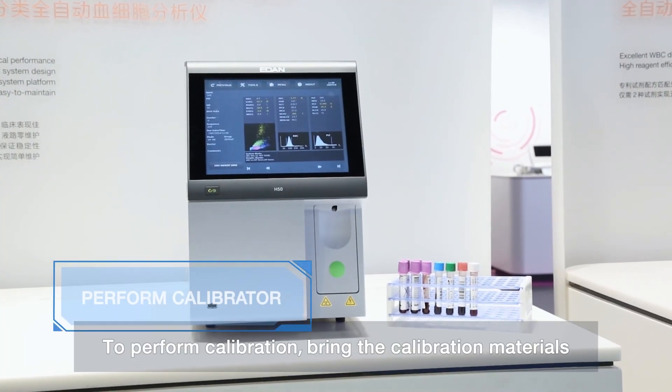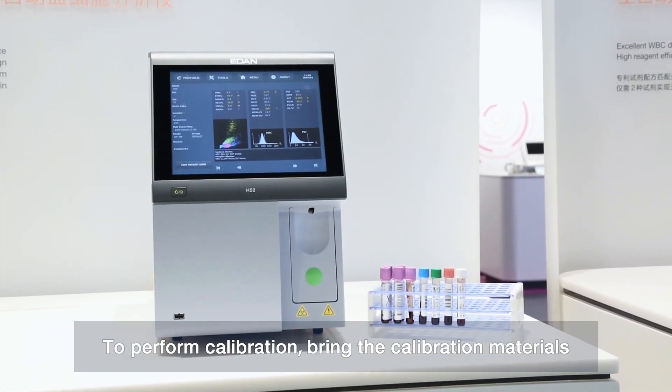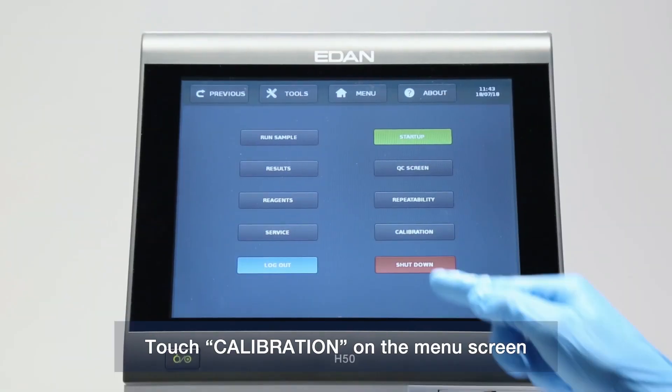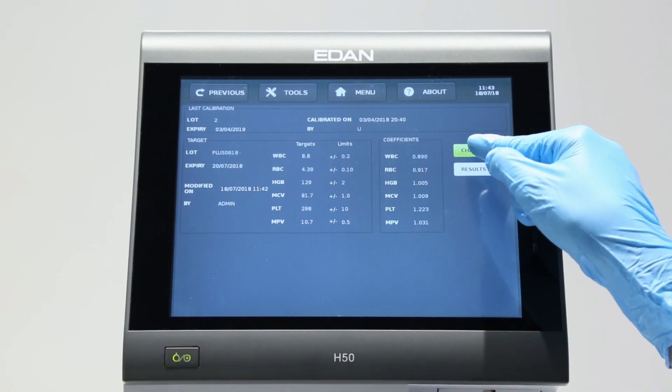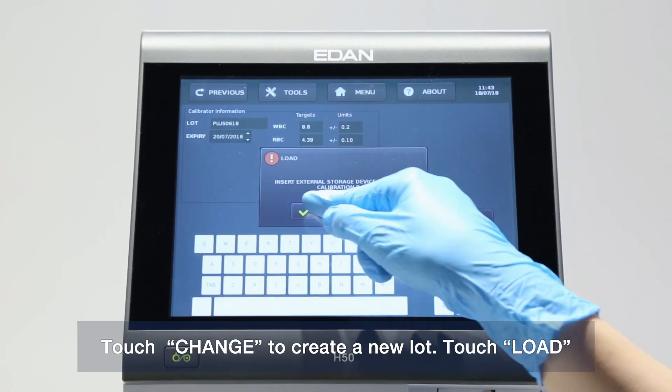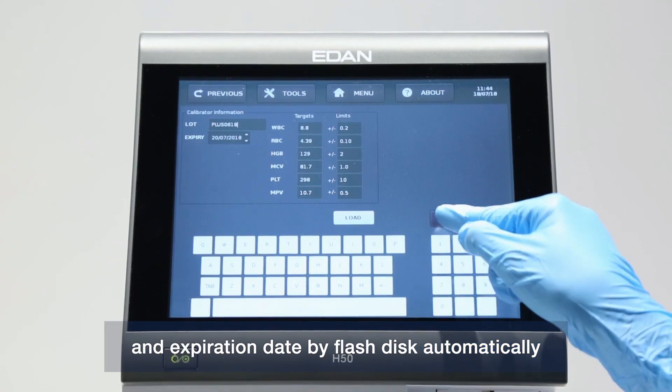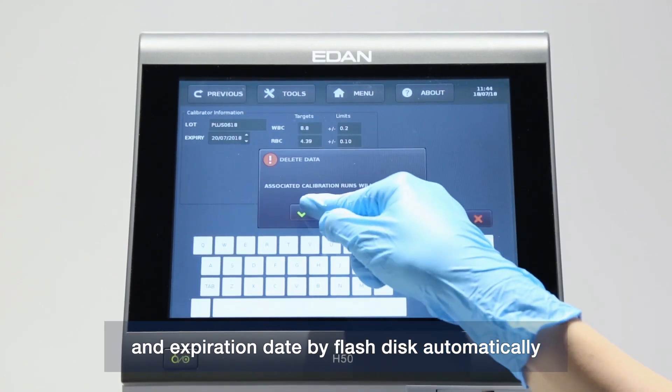To perform calibration, bring the calibration materials to room temperature for 15 minutes. Touch Calibration on the menu screen. Touch Change to create a new lot, then touch Load. You may load the target value, lot number, level, and expiration date automatically via flash disk.